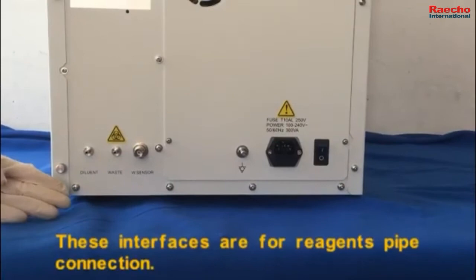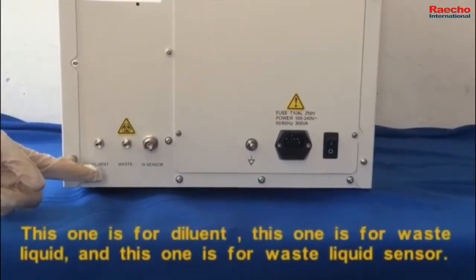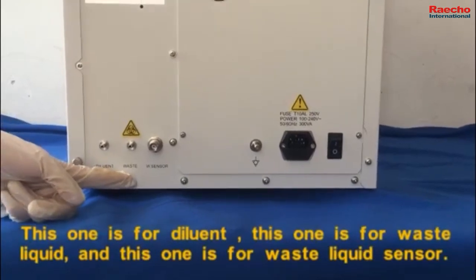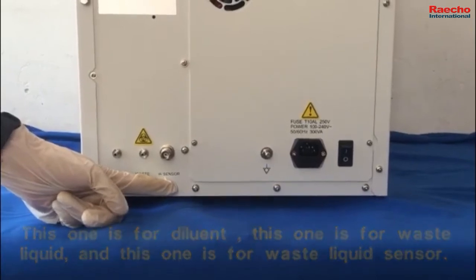These interfaces are for pipe connection. This one is for diluent. This one is for waste liquid, and this one is for the waste liquid sensor.